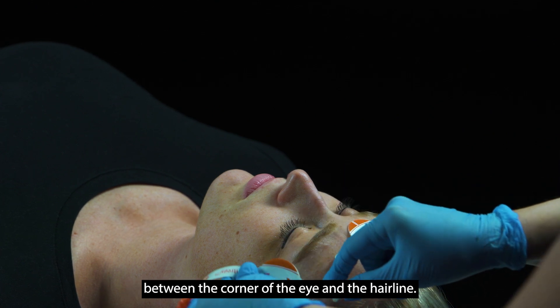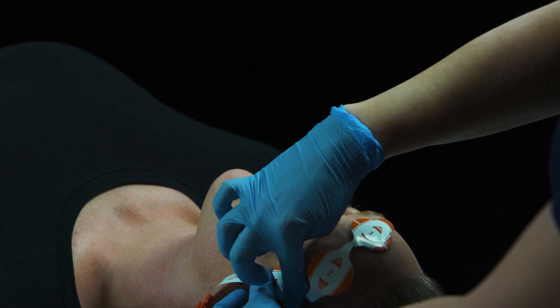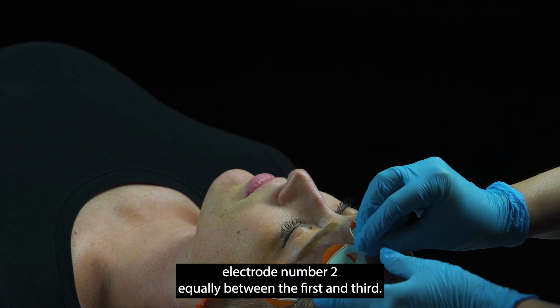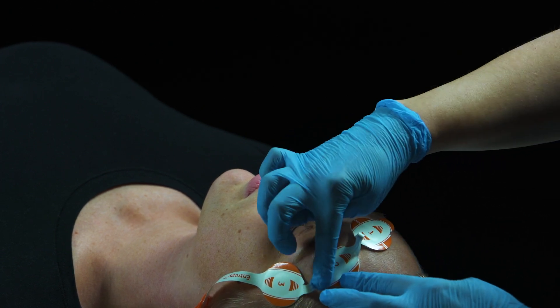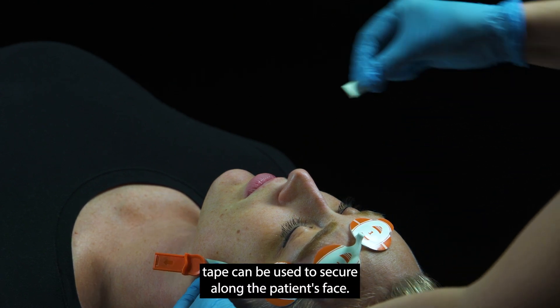Apply electrode number three on either temple area, between the corner of the eye and the hairline. Lastly, place the second electrode equally between the first and third. If necessary, tape can be used to secure along the patient's face.